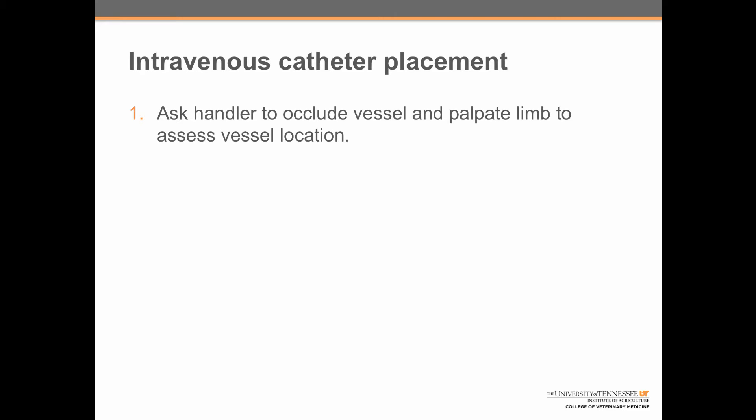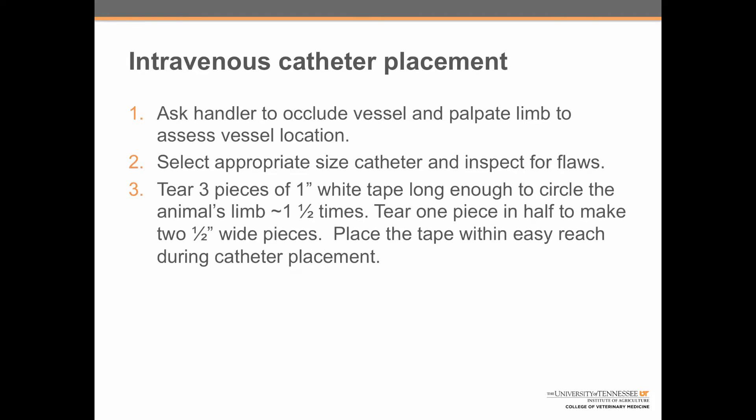There are 14 steps to intravenous catheter placement. Step 1: ask the handler to occlude the vessel and then palpate the limb to assess vessel location. Step 2: select an appropriate size catheter and inspect it for flaws. Step 3: tear three pieces of one-inch white tape long enough to circle the animal's limb one-and-a-half times. Tear one piece in half to make two one-half-inch wide pieces. Place the tape within easy reach during catheter placement.